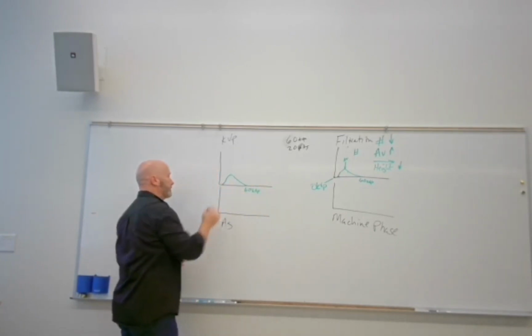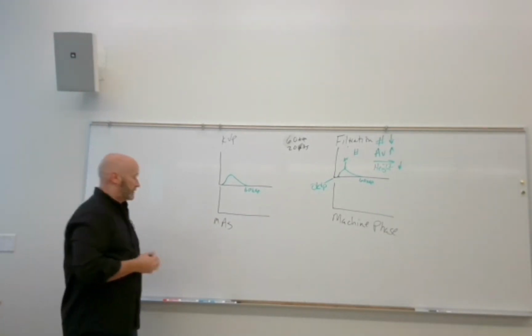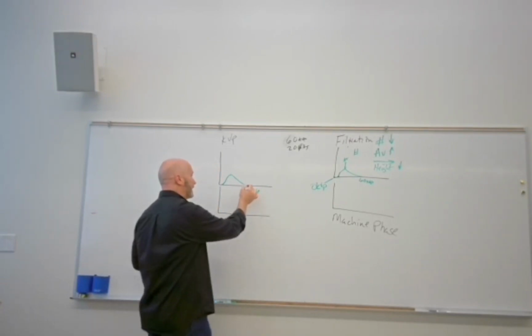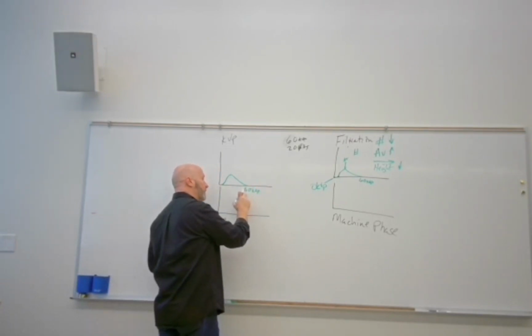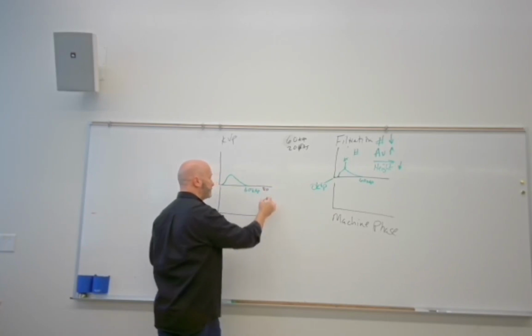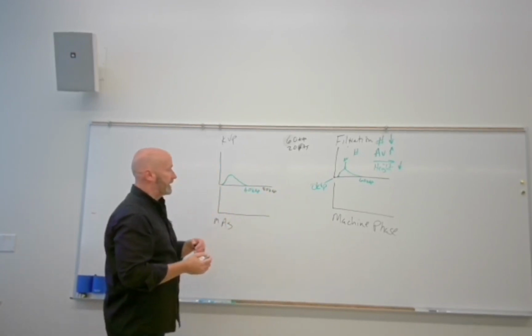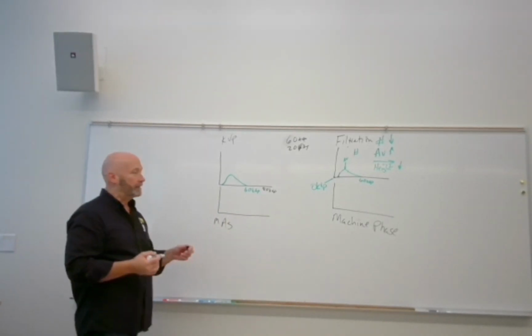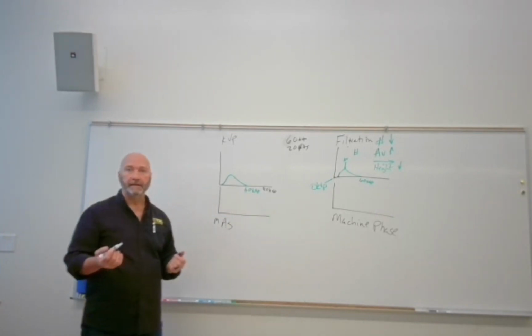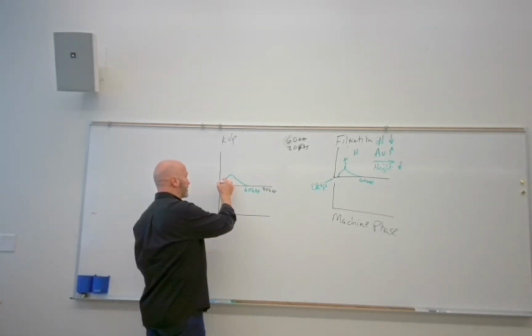What is it that affects the minimum energy? It's only one thing, filtration, right? So now we're going to change our kVp. With the changing kVp, we're going to move off of 60 kVp and go to, let's say, 80 kVp. What we're going to see with a change from 60 to 80 kVp, which is massive, right? A 15% change from 60 kVp would be roughly 69. I didn't go with a 15% change for what's going to be an obvious reason.